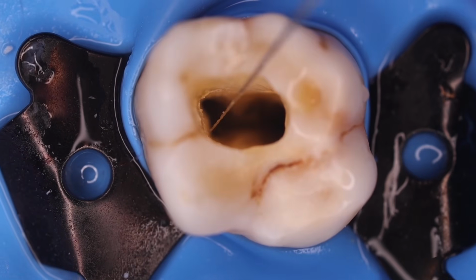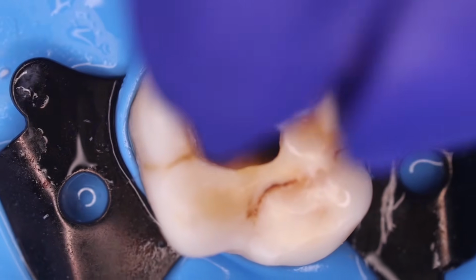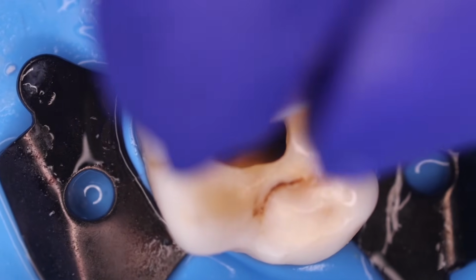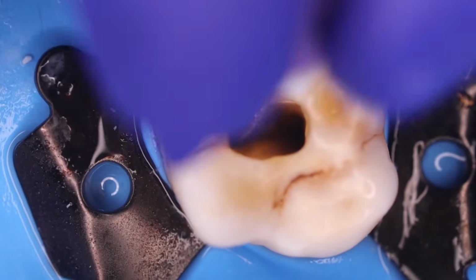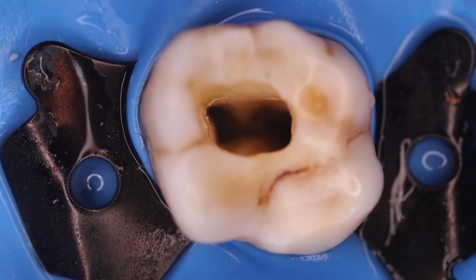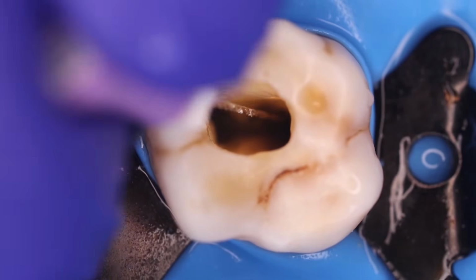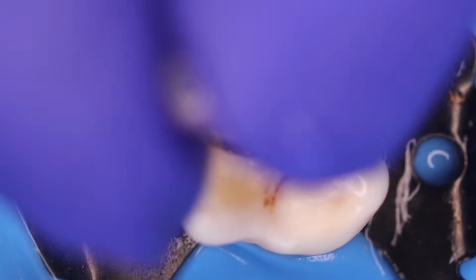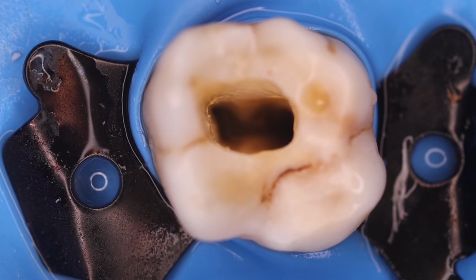Now let us explore the distobuccal canal. Over here, distoangularly, we are able to insert the file into the distobuccal canal, and then comes the palatal canal. We are able to insert the file into the palatal canal. This file is loose. These are the canals that we have identified.